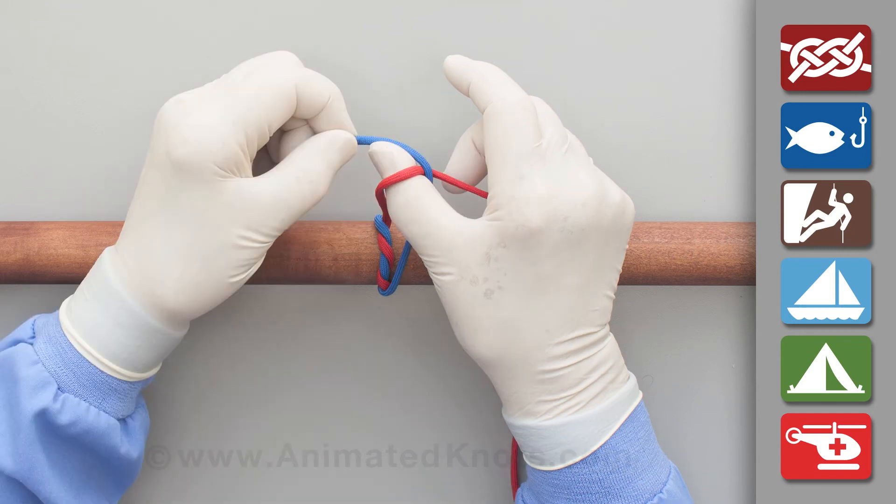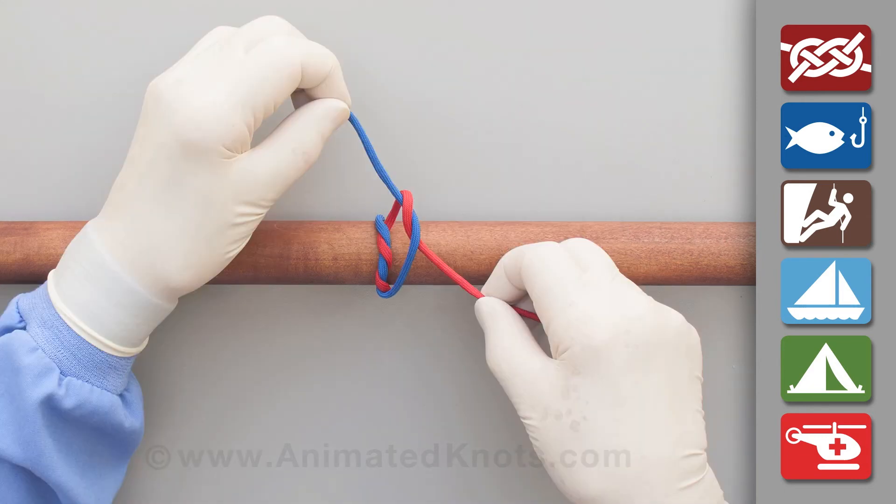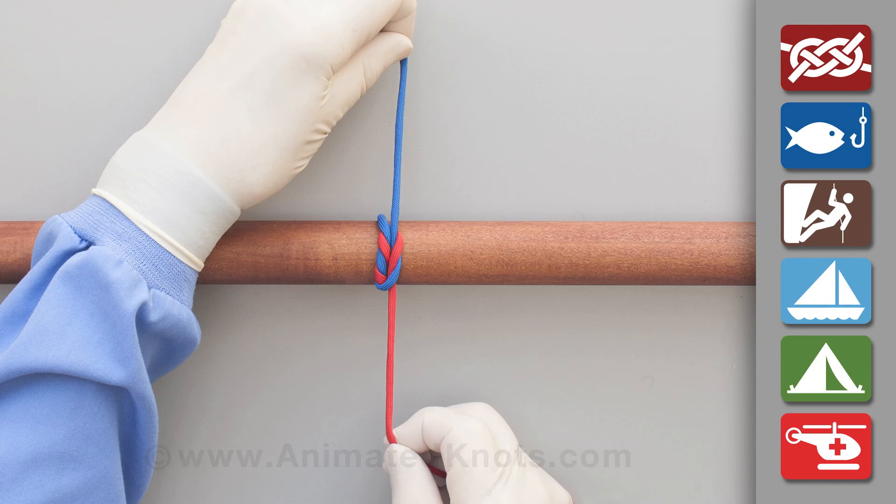Lay the short end between finger and thumb, and use the finger to push the end through to complete the knot and pull it tight. For security, this knot is usually followed by more half knots.